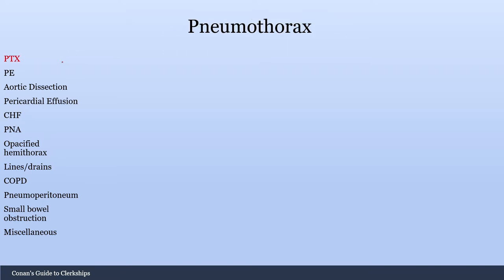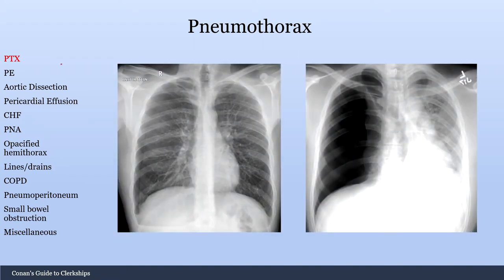Let's talk about pneumothorax. Here are two pictures of pneumothorax — the one on the left is a normal pneumothorax, and the one on the right is a tension pneumothorax. If you look closely, you can see this white line going across — this is called a white visceral pleural line, and is one of the signs you can see in a pneumothorax.